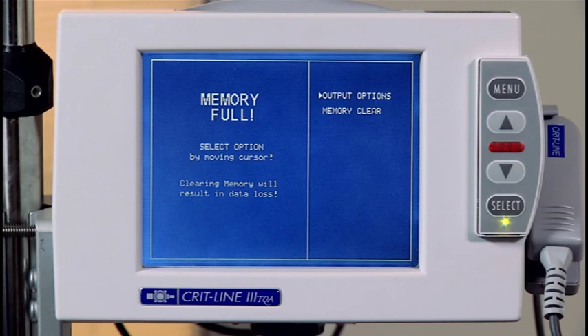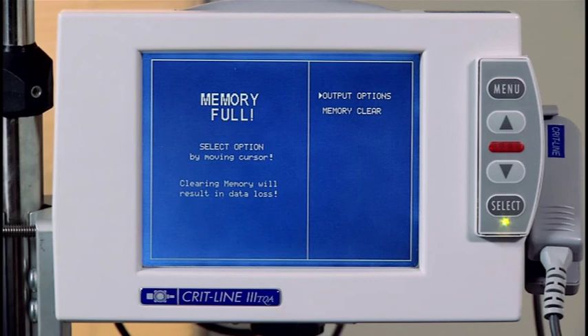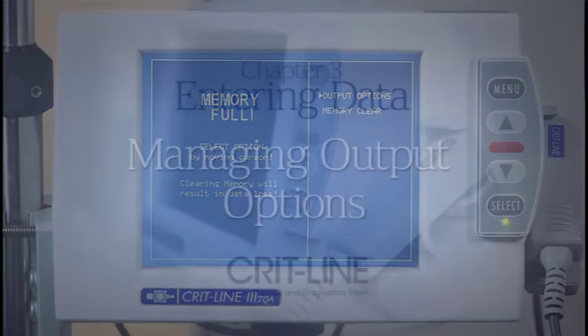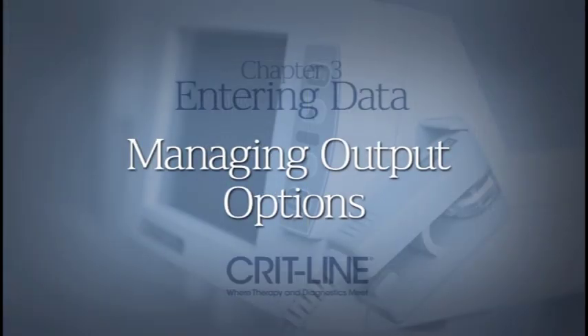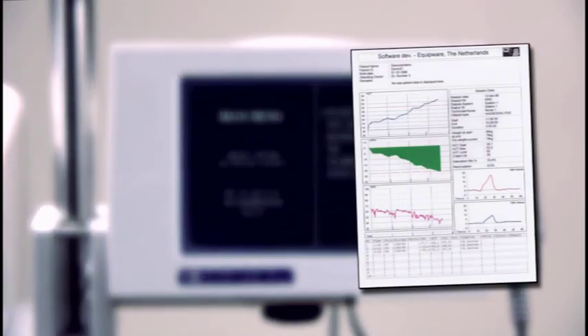If you want to print or download the data from a previous treatment, move the cursor to output options and press the select button to enter the output menu. The CRITLINE monitor stores up to 26 hours of data and provides a significant amount of treatment data. A treatment profile will include hematocrit, blood volume change, and oxygen saturation profiles all on one sheet of paper.